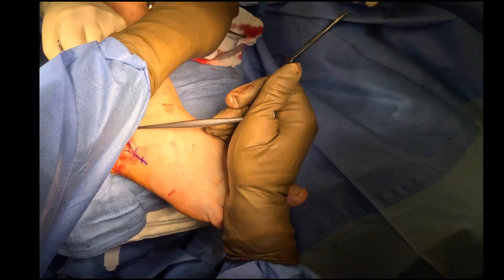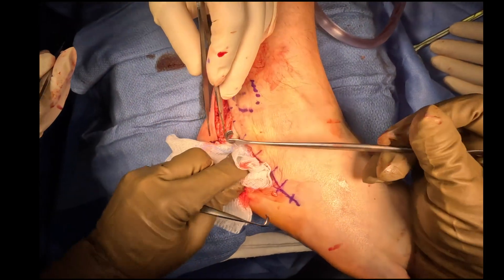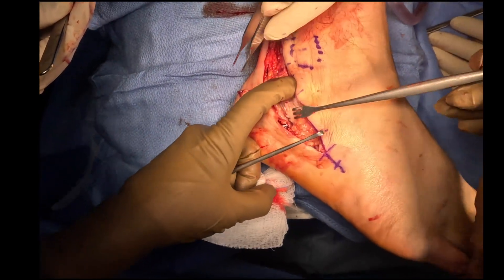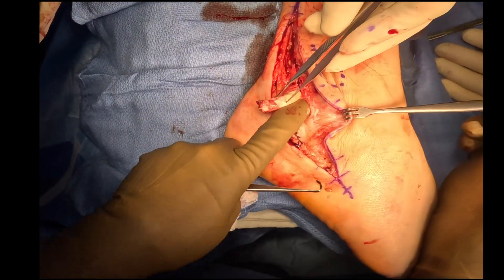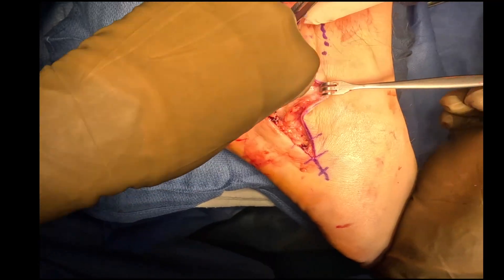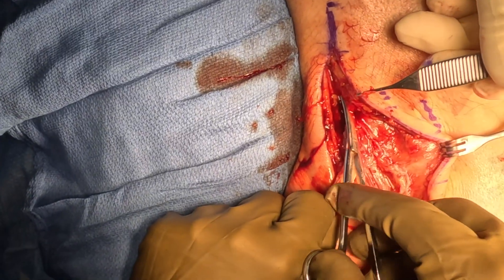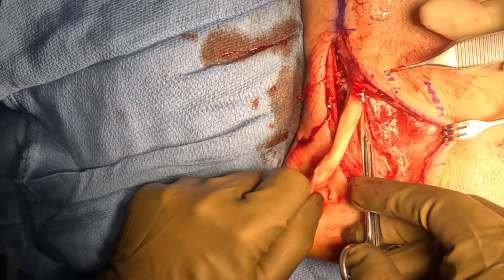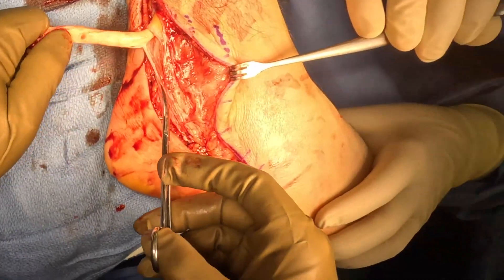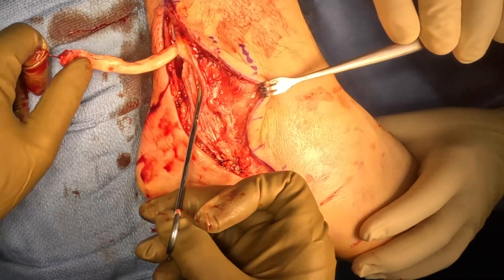There you can see the longus tendon — it's completely ruptured. We're resecting it and pulling it back from its rupture site. One technique I teach my students and residents during surgical dissection: an easy way to remember which tendon you're encountering is that you'll normally find the longus first, and the brevis is tucked up against the fibula. I always remember B for brevis against bone.